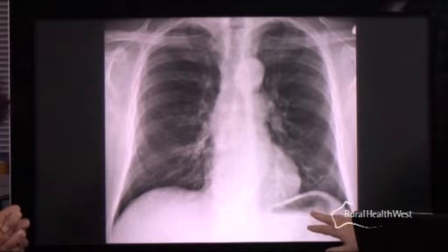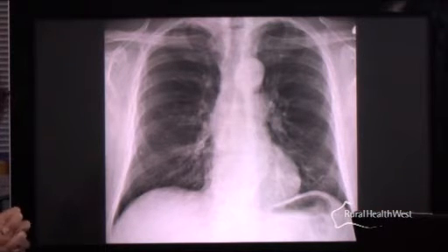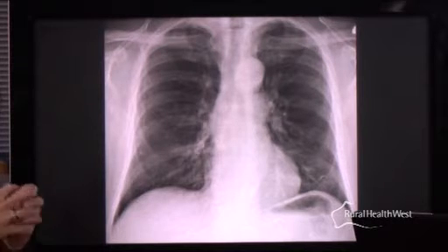After that, I go and look below the diaphragm. I make sure that the gas bubble is on the correct side. That will actually help you know that it is the left side of the film. If someone's mislabeled it incorrectly, it'll tell you if there's free gas beneath the diaphragm. You may see a hiatus hernia associated with that. So looking in the upper abdomen is certainly worthwhile. And then if the patient is in a situation where they've got nasogastric tubes or other tubes in or lines, then have a look at all the lines and make sure they're all satisfactorily placed.